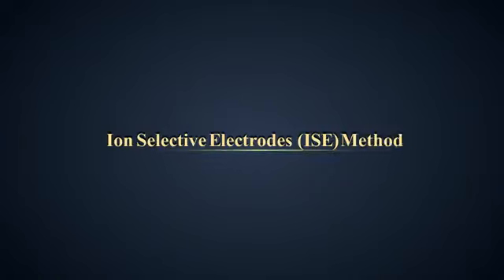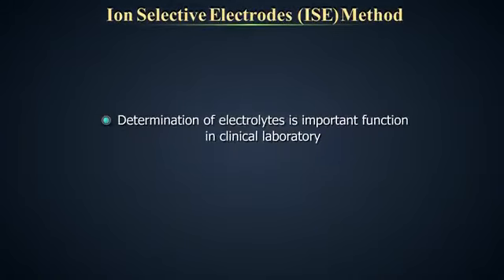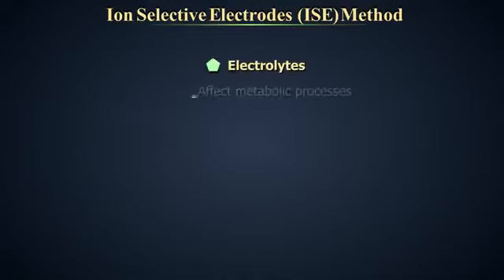Measurement of electrolytes by Ion Selective Electrodes method. The determination of electrolytes, sodium, potassium, and chloride, is one of the most important functions in a clinical laboratory. Electrolytes affect most metabolic processes.